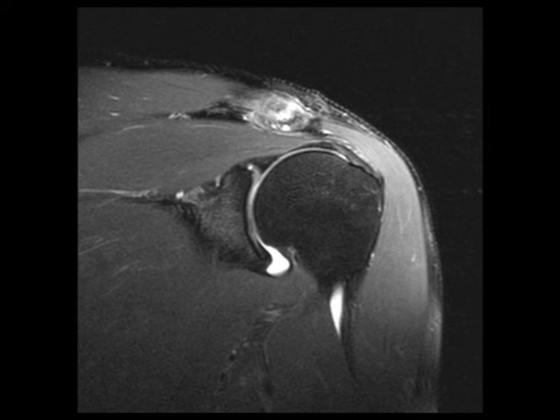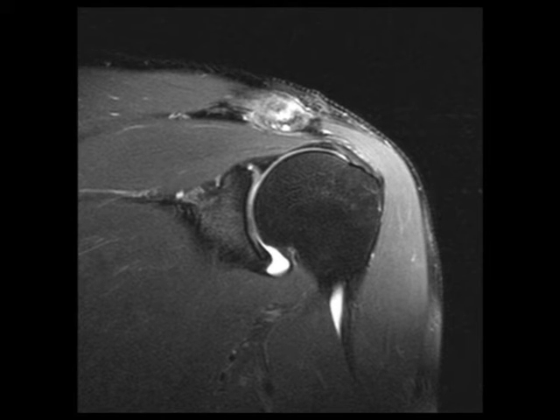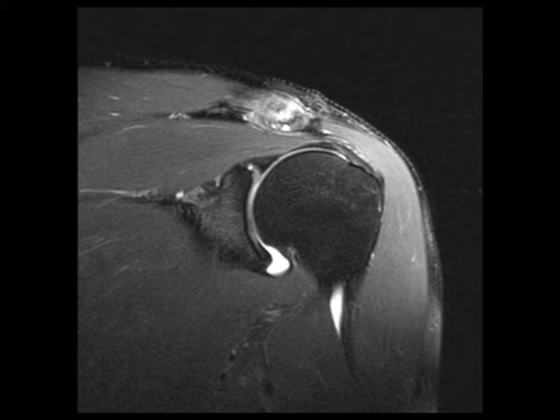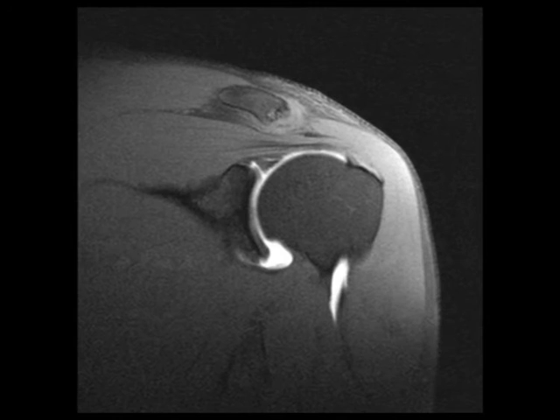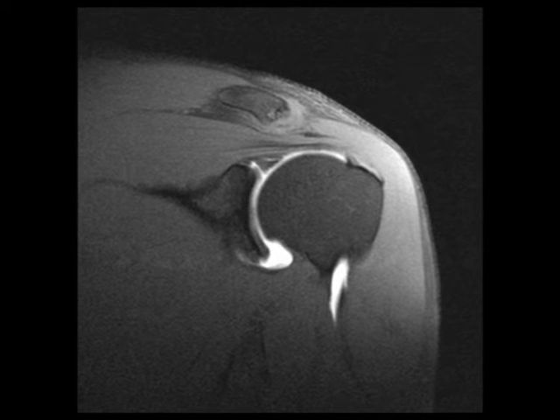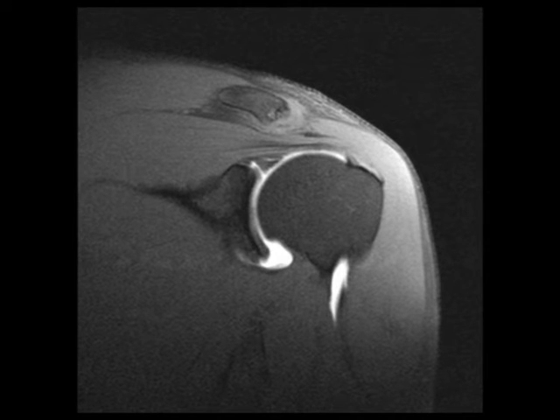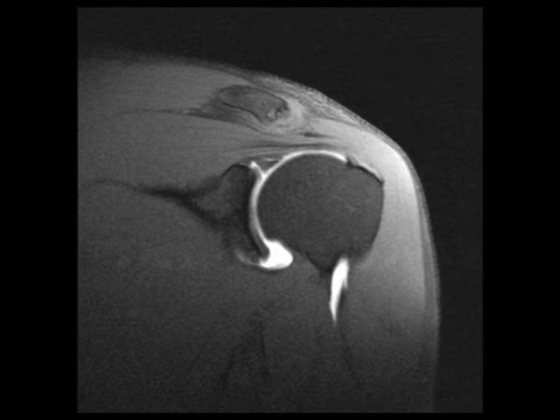This is a 36-year-old male with chronic left shoulder pain. The MR arthrogram images demonstrate a chondrolabral separation at the superior aspect of the left glenohumeral joint, compatible with a type 2 SLAP tear.